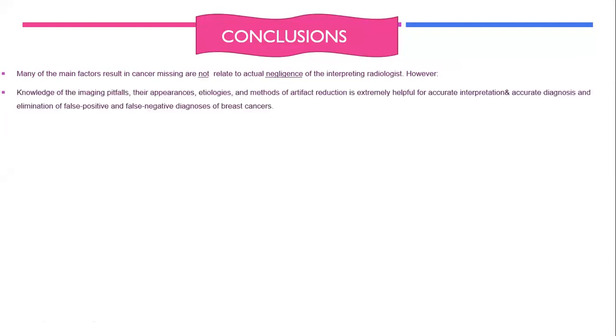Okay, so in conclusion, many of the factors for breast cancer misses are not related to actual negligence of interpreting physicians. However, knowledge of imaging pitfalls, their appearance, etiologies and methods of artifact reduction is extremely helpful for accurate interpretations and accurate diagnoses and elimination of false positive and false negative diagnosis of breast cancer.